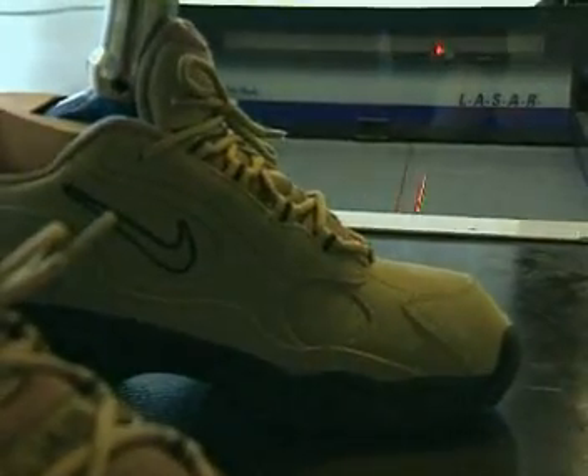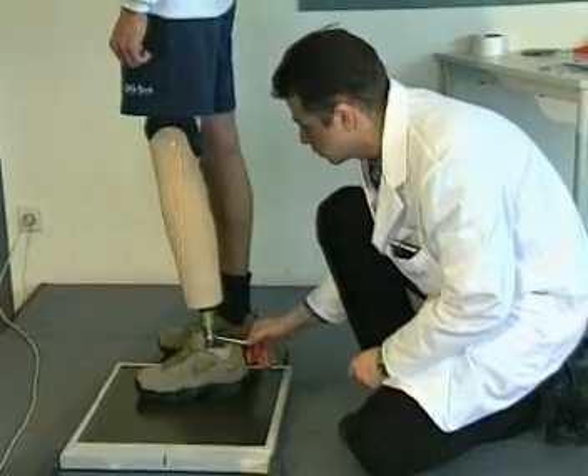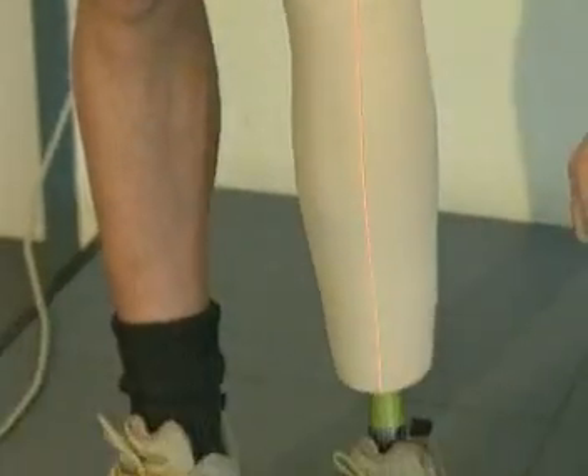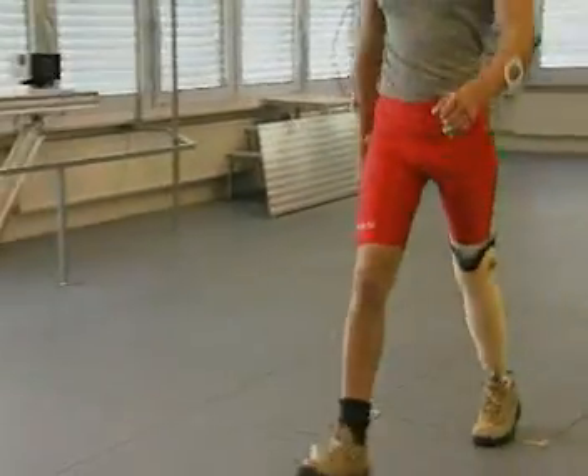The laser posture measurement tool may be used to verify and document optimal alignment. In the frontal plane, the limb load line should contact the lateral border of the patella.